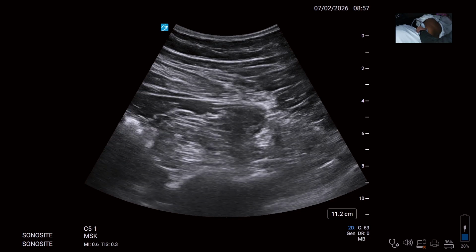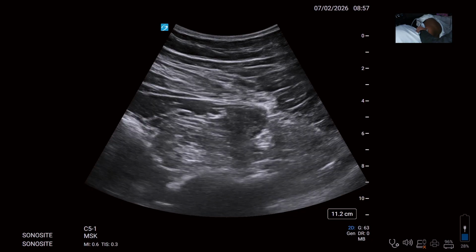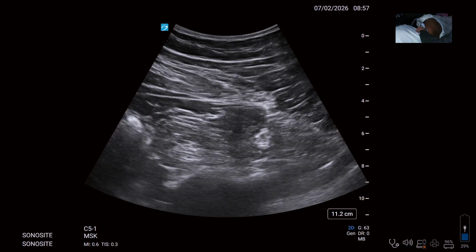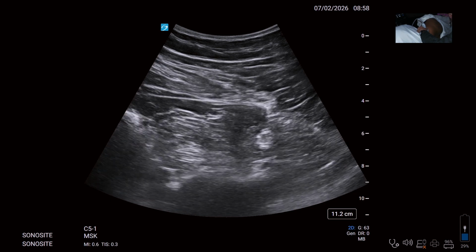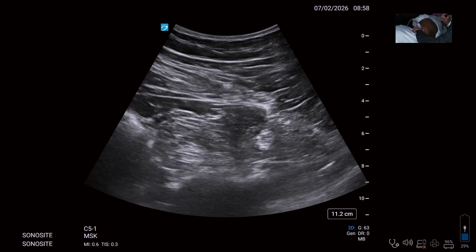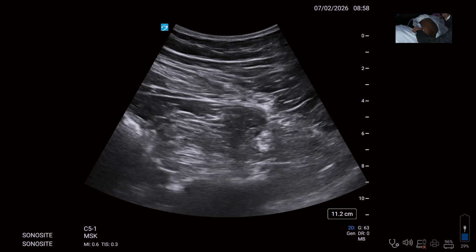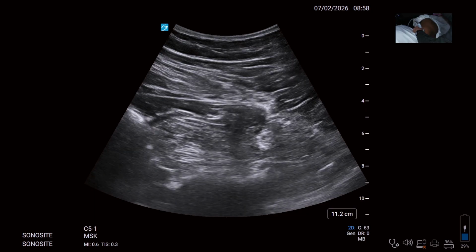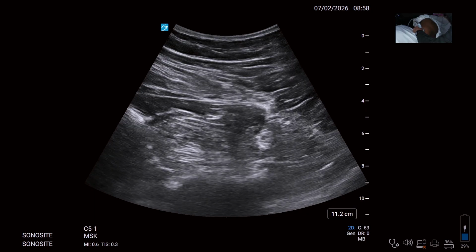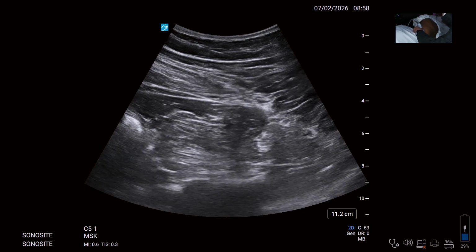I need to use a dual guidance, that means a peripheral nerve stimulator along with it. And if you closely observe this place, you might observe certain pulsations. These are pulsations of the dorsal branch of the lumbar artery. So we might get it in our needle path. So this is the cause for retroperitoneal hematomas. So a good knowledge of the anatomy, a good resolution machine helps you in identifying the vessels and avoiding complications.